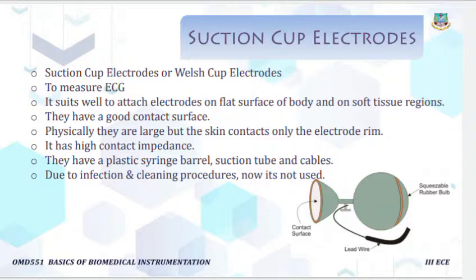Physically, they are large in size, but the skin is in contact only at the rim point, so it has high contact impedance. They have a plastic syringe barrel, suction tube and cables. That is, it consists of a plastic syringe barrel, suction tube and cables.